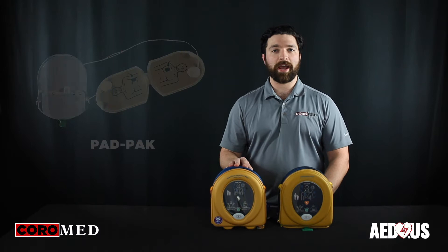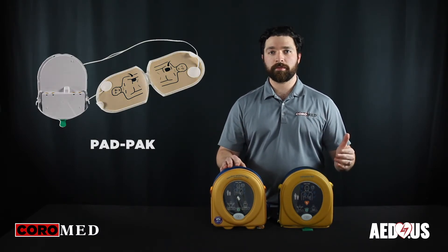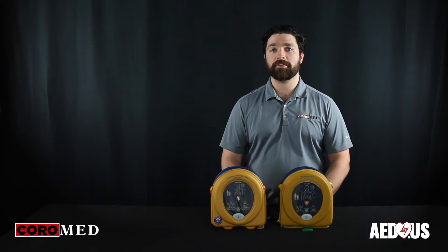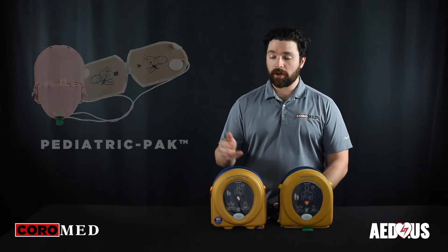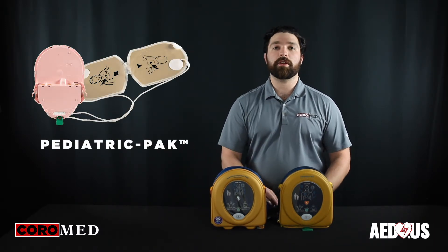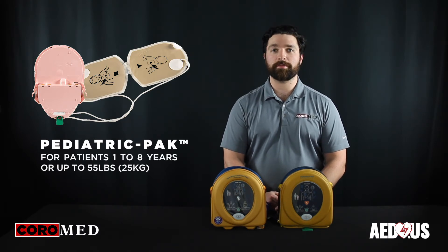The HeartSign uses a proprietary pad and battery combination with a full four-year shelf life, making these some of the easiest and lowest cost to maintain devices on the market. They also offer a pediatric version which can be used on patients under eight years of age or 55 pounds or less.